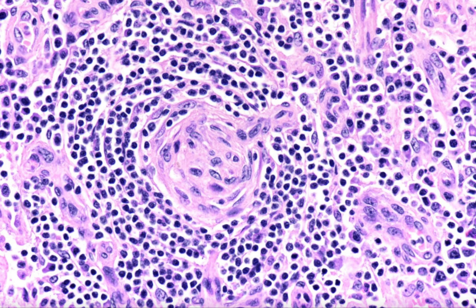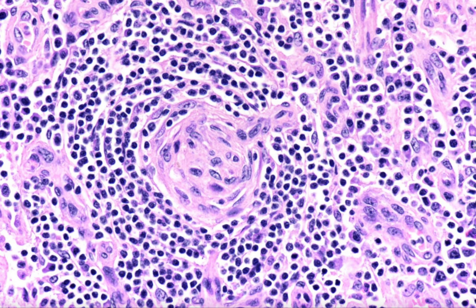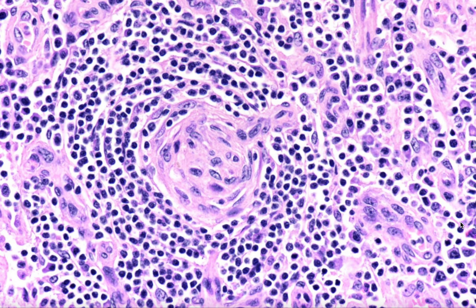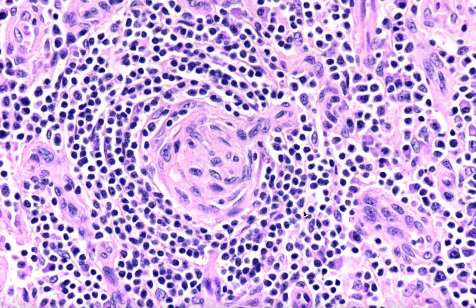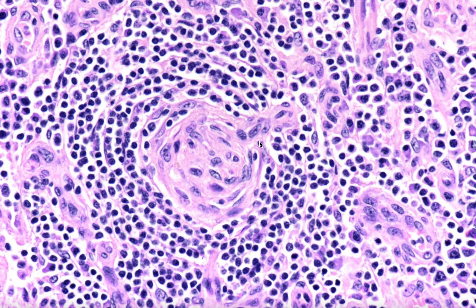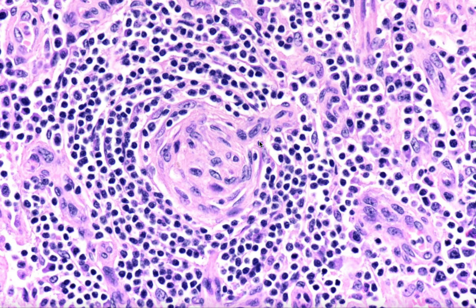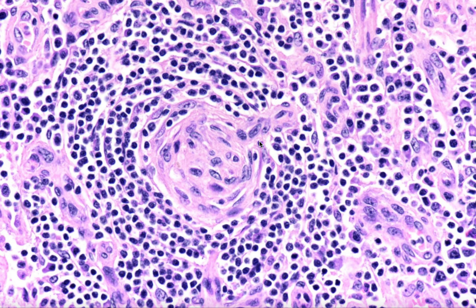This is an example of what we call a regressed germinal center. It can occur in the setting of florid follicular hyperplasia, or in the setting of single-site disease or multicentric Castleman's disease, either the hyaline vascular variant or plasma cell variant, or in the multicentric Castleman's disease setting.